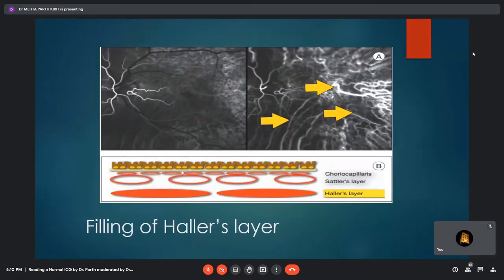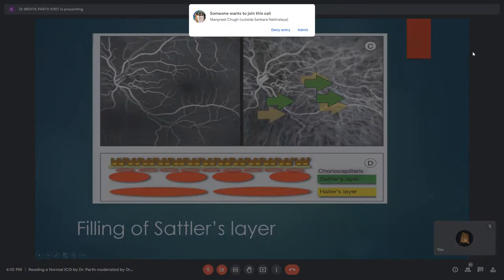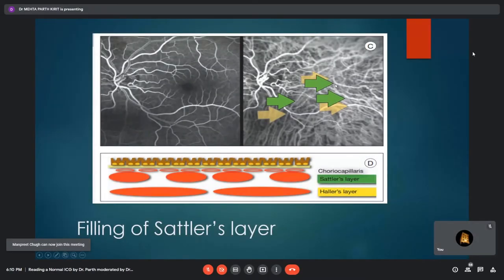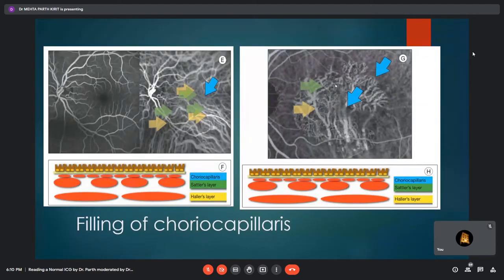The first choroidal vessels to fill are those of the deeper Haller's layer, which is composed of large caliber non-fenestrated vessels. This is followed by filling of the intermediate Sattler's layer, whose vessels are smaller in caliber compared to Haller's layer. The choriocapillaris is the last layer to be filled. The sequence of filling therefore progresses from the biggest and outermost to the smallest and innermost vessels.